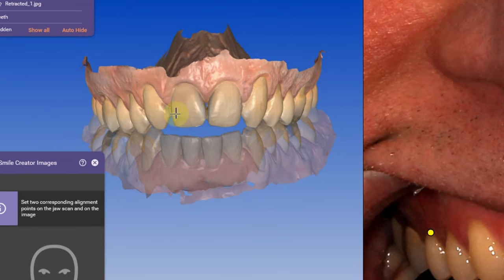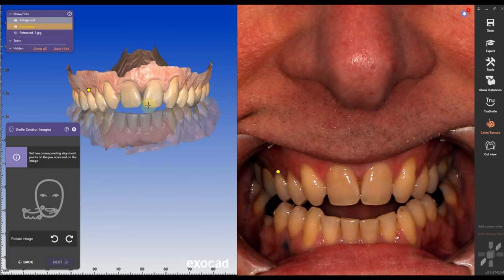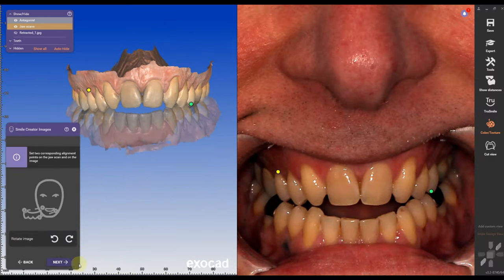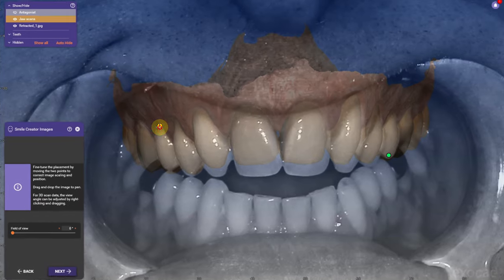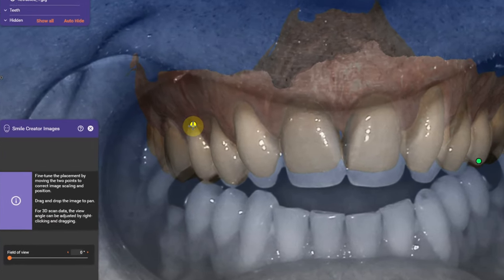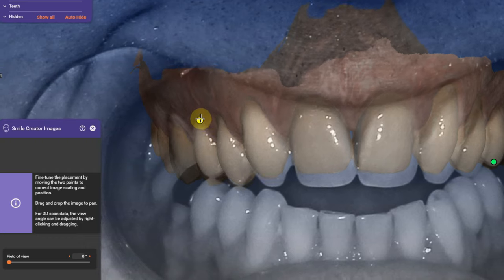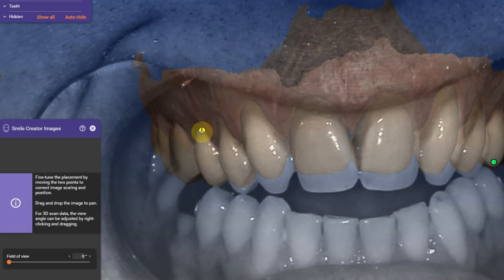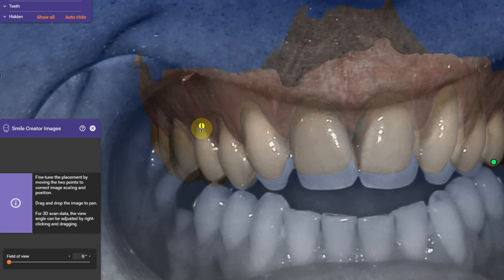I'm gonna click on the gingival of the second bicuspid and in the same position in the scan. Then I'm gonna move diagonally to the second bicuspid on the cusp and click on the same position in the scan. I'm gonna go next and I can see the picture is pretty well aligned with the yellow dot.